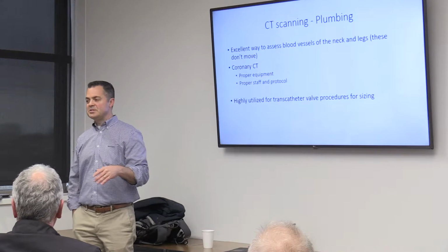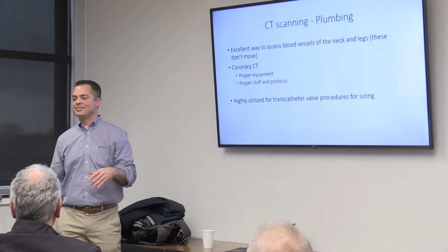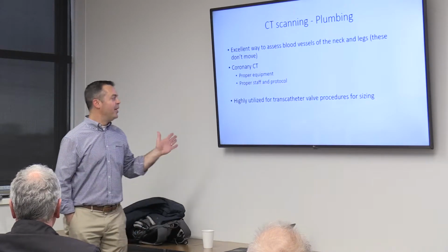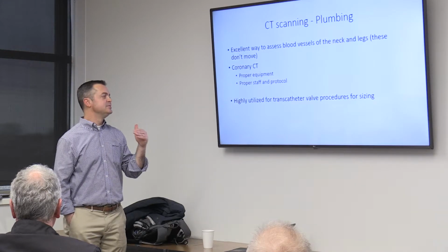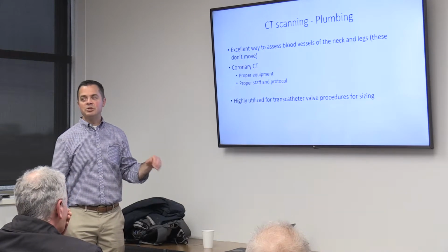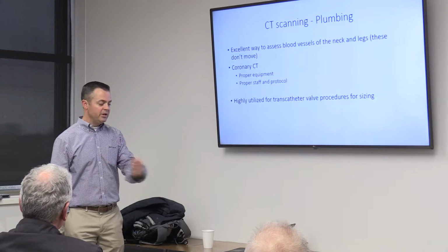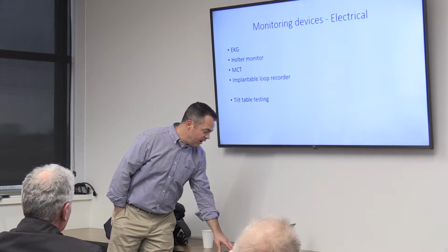Yeah, 64 slice CT scanner, no one's going to want to buy that if you're selling it. It's like a really old used car. Yeah, no, this CT scanner we have now is pretty impressive. But more so, it's the people doing it. I mean, it really is. You've got to know what you're doing here. Like you said, you gotta know to get that heart rhythm slowed down and regular.